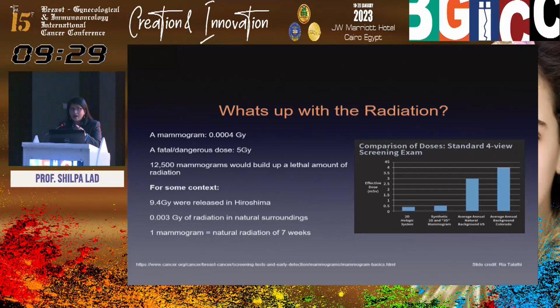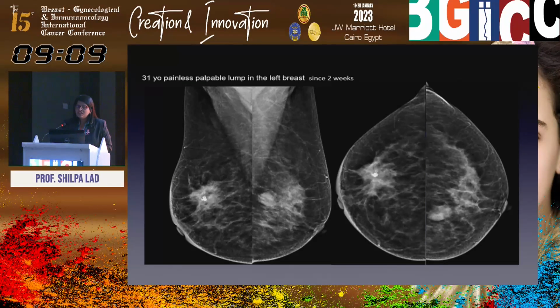So with one mammogram, they are never going to reach those levels. We are not talking about screening mammograms from 20 years of age. We are talking about that one diagnostic mammogram. You make the patient understand, make the referring clinician understand, do it, because it will help you come to a diagnosis, okay?